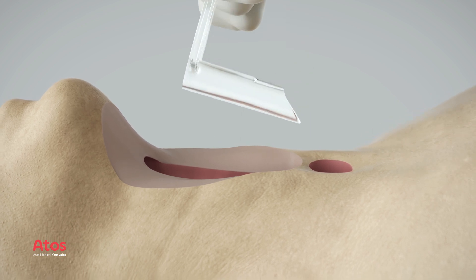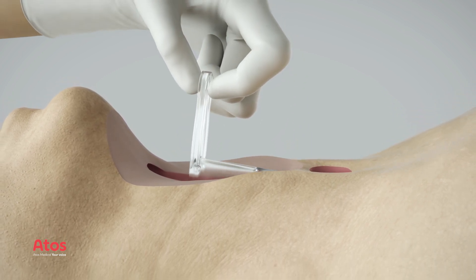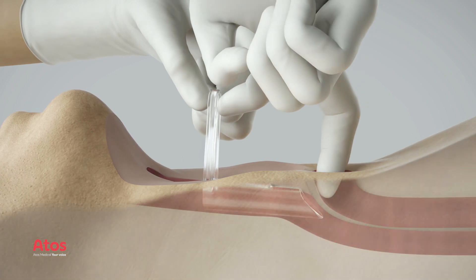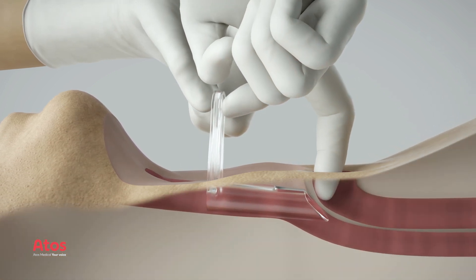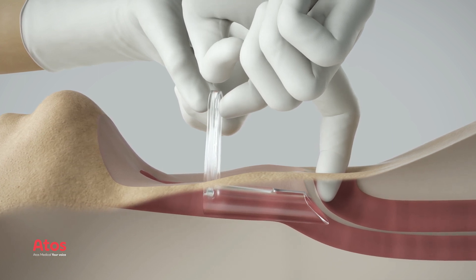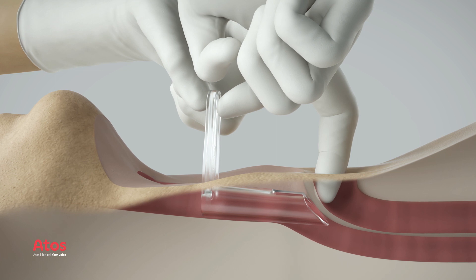After removal of the larynx and creation of the tracheostoma, insert the pharynx protector in the esophagus. Verify the correct location for the TE puncture by palpating the inside of the trachea. The oblique front opening of the pharynx protector should be felt during palpation.